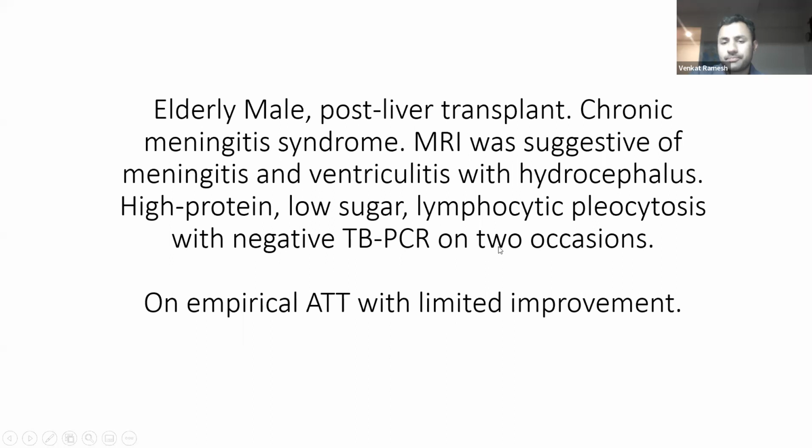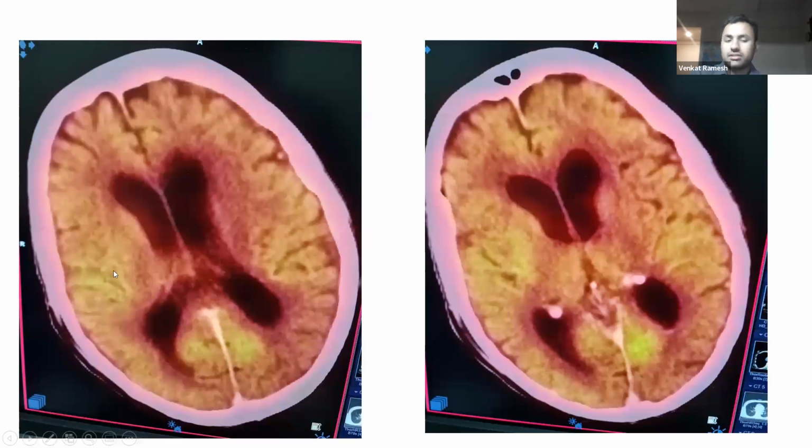So this is another patient, for example, where we would be quite keen on getting whole body imaging done to look at other sites for tuberculosis. And in this gentleman, actually, there was only brain involvement, as you can see in the left temporoparietal lobe. There's increased uptake. So PET-CT did not reveal any evidence of disease outside the CNS.